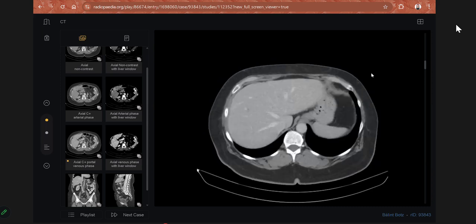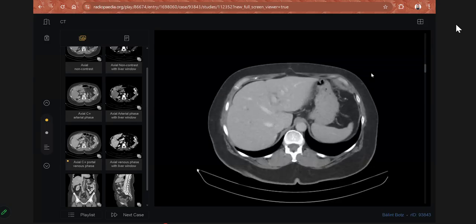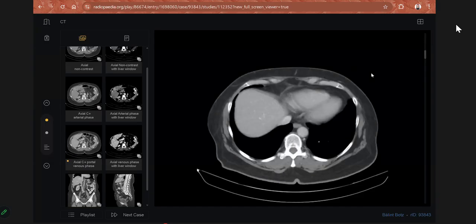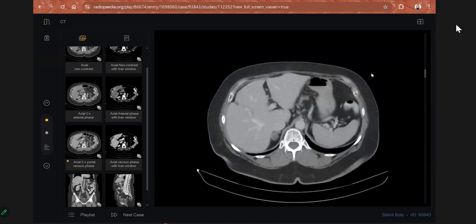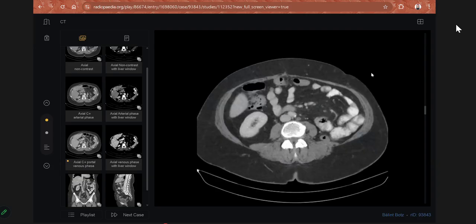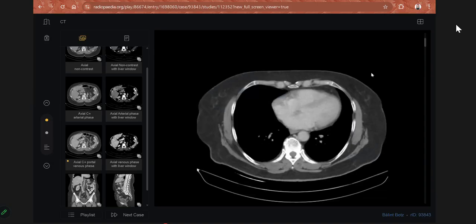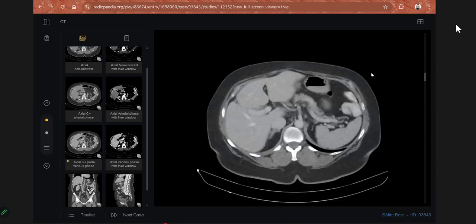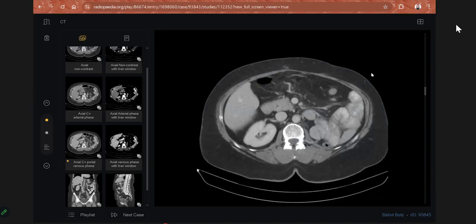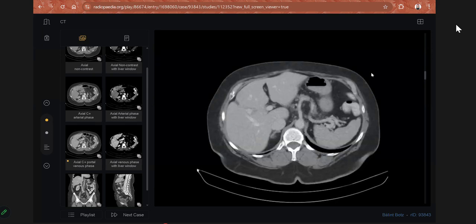What about the margin of the liver? Does it appear normal or cirrhotic? No, the liver appears fine to me. Then what do you think? If the liver is normal, what is the other differential? If the liver is fine, I would think of the possibility of adenoma, which also shows early enhancement, but it does not show washout. Yes, I can also think of a metastatic disease process.